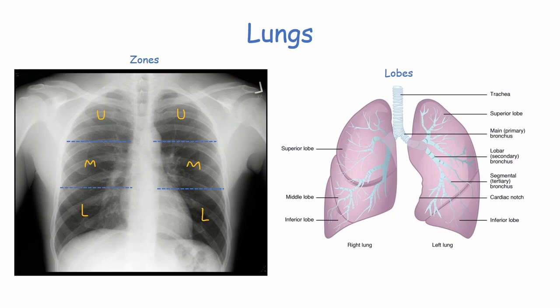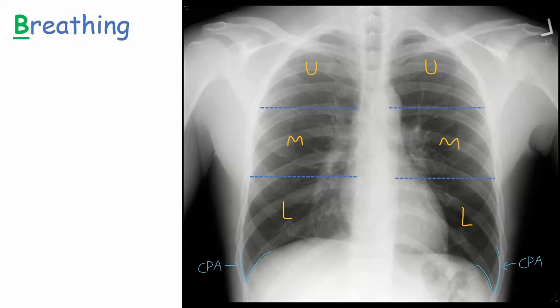The right lung has three lobes — superior, middle, and inferior — whilst the left lung has just two, superior and inferior, with a small section called the lingula. When assessing the lungs, we need to compare the three zones from left to right, checking for any asymmetries that could be caused by pathology. The lung should have normal markings bilaterally, without any areas of increased density excluding normal anatomy. Normal lung markings should also be visible up to the edge of the lung field to exclude a pneumothorax.